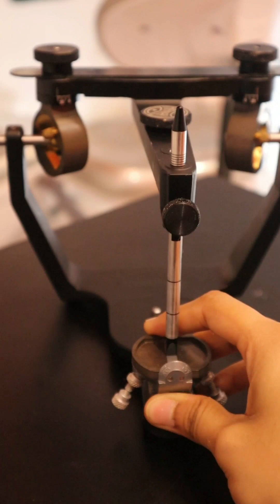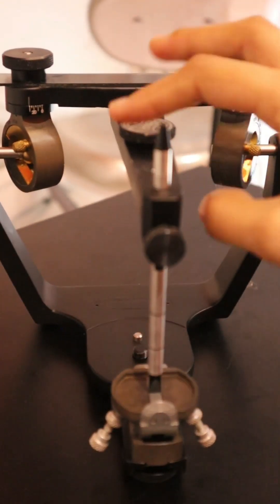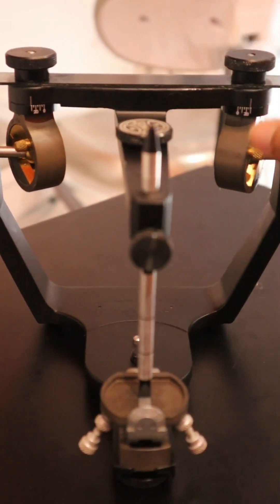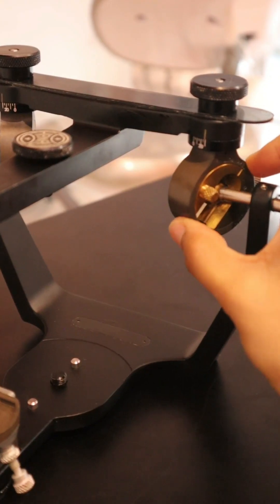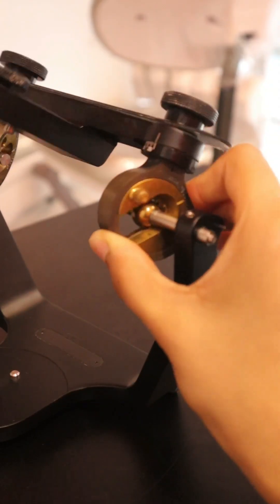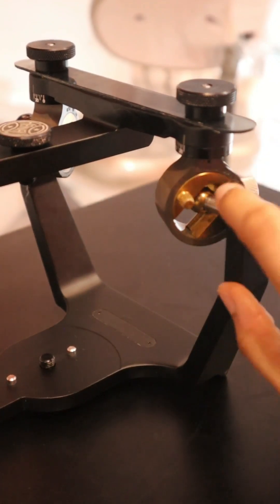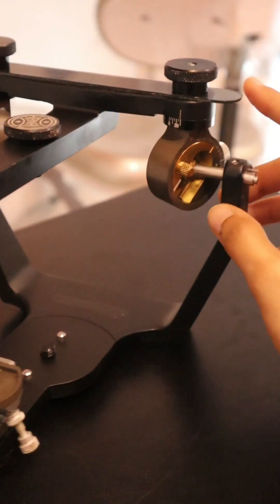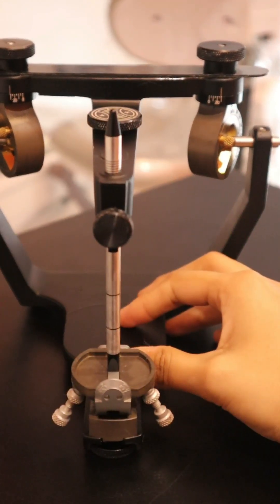And this is the condyle member as I'm showing you. As you can see over here, the condylar guidance is situated in the upper member, and the ball which is present represents the condyle—the condylar element—which is situated in the lower member.